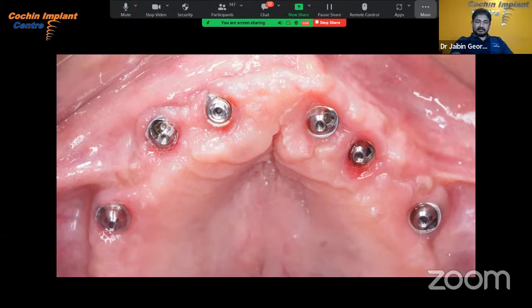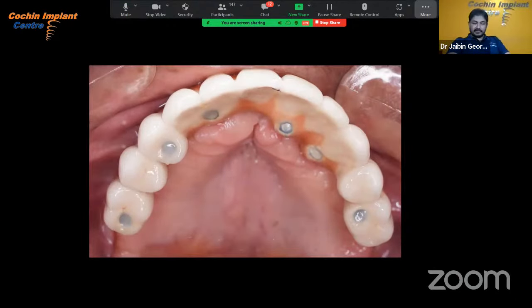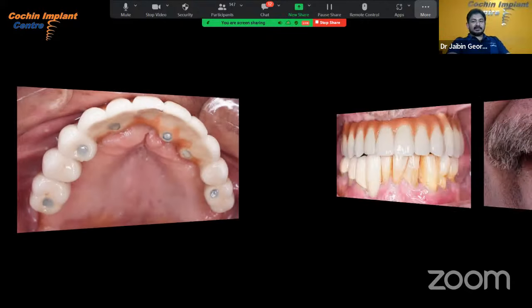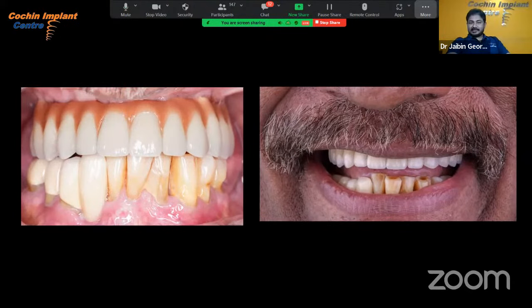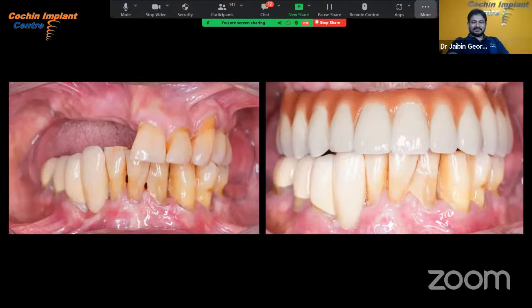And after 3 months, when the implants are integrated, we have removed the screw-retained prosthesis, and we are converting the conversion prosthesis into a screw-retained PFM prosthesis. This is the PFM prosthesis, which we made after three months. And this is the smile of the patient before and after.